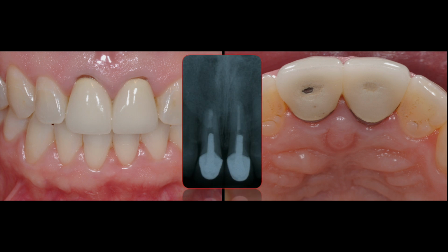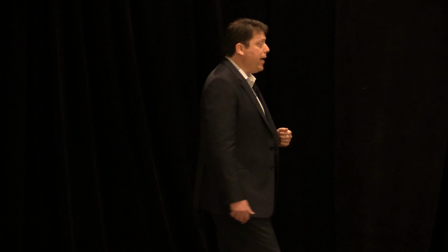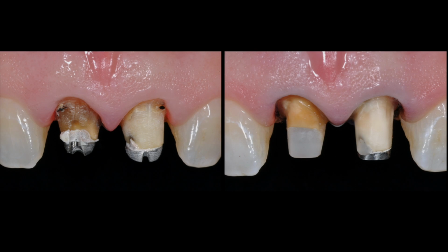So if we look at this patient here, this patient has 2 failing metal ceramic crowns. These are 2 simple centrals. This is what we see on a daily basis in your offices. And as we remove those crowns, you can see that we have a discolored abutment and another abutment that is not as discolored. We're going to redo one of the endodontic treatments because of symptoms that the patient has. And this is how the patient looks when the preparations have been refined after the endodontic therapy has been completed and a new post and core has been placed.